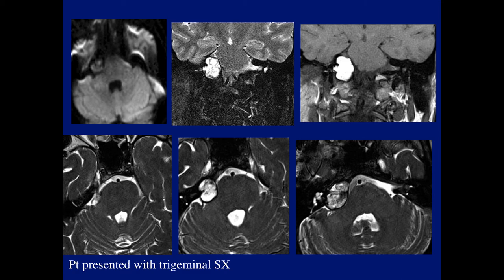No diagnoses at all? Okay, one possibility mentioned is a schwannoma with degeneration. Several people mentioned that possibility. Cystic meningioma was also mentioned. All are interesting possibilities.